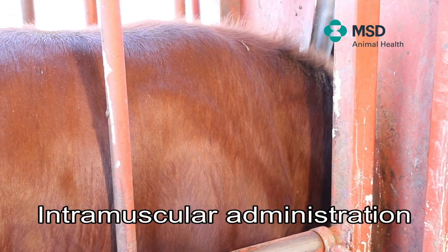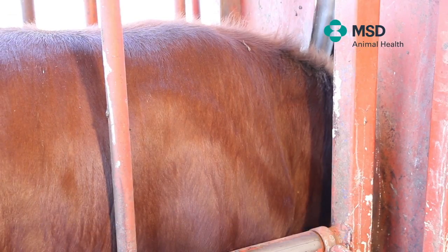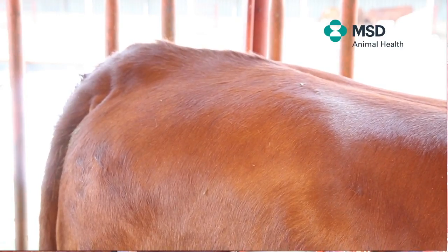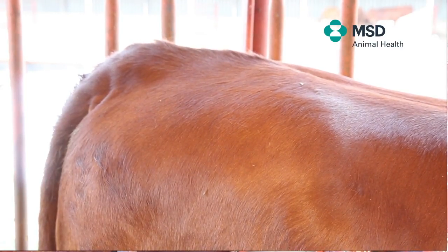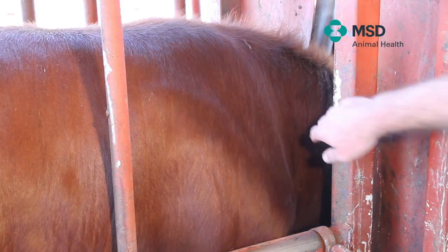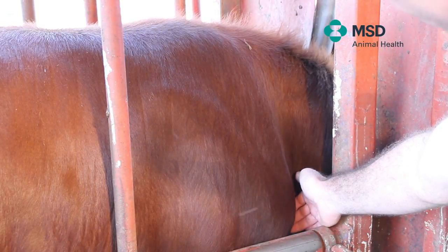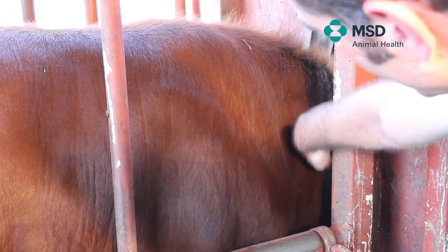In this video we'll be discussing intramuscular injection. Two areas are used for this technique, one in the neck area and one in the rump area. The neck area is preferred to the rump area, as the rump area is the most expensive cut of meat and we don't want to damage it. The area is demarcated by the bottom of the spine, point of the shoulder and the top of the jugular groove.